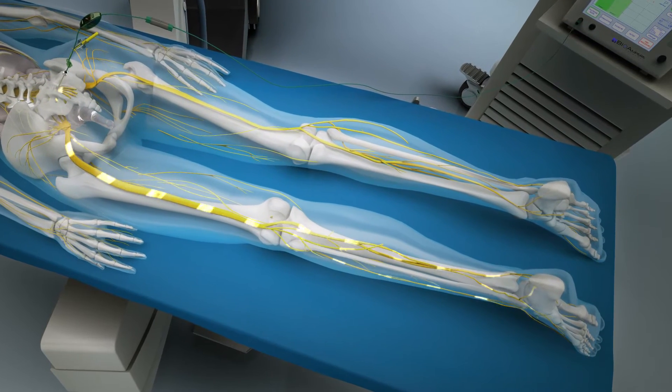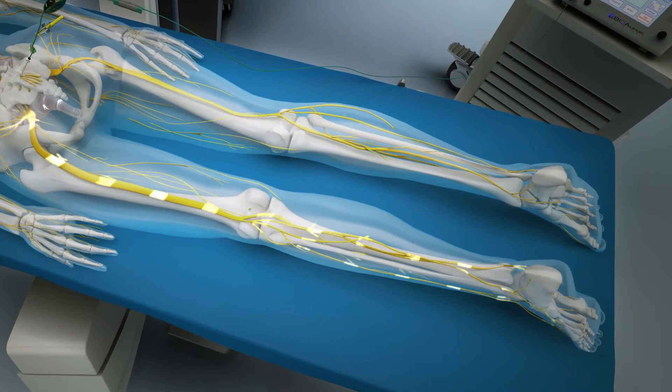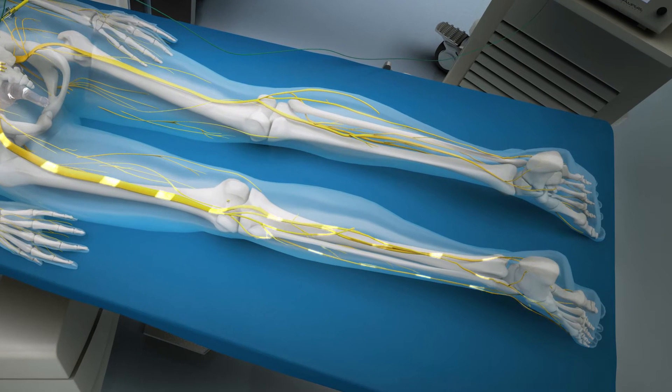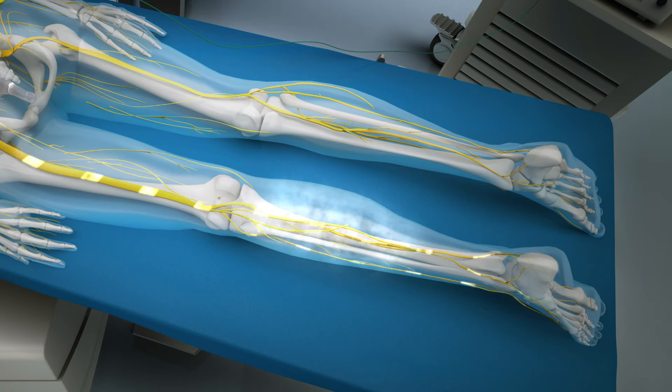This technique is extremely accurate because it is conducted with a patient who is awake and will report the location of the stimulation evoked, thus contributing to the exact positioning of the lead.